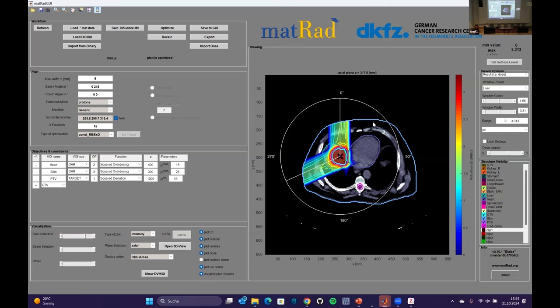So think about the nose. You hear it, I got a little bit sick, so I had a clogged nose. Now think about, I get an image of my head, super healthy. Someone plans proton beams through my nasal cavities. The nasal cavities are nice and empty. There's air in there, so nothing stops, and my proton beam stops exactly in the tumor.